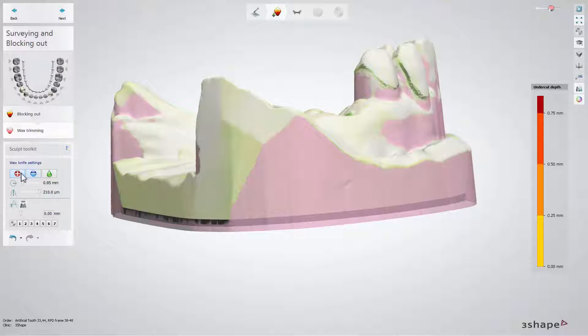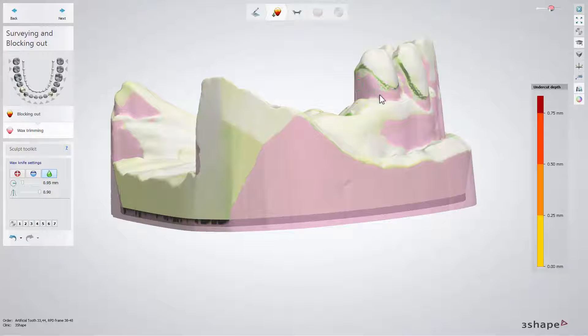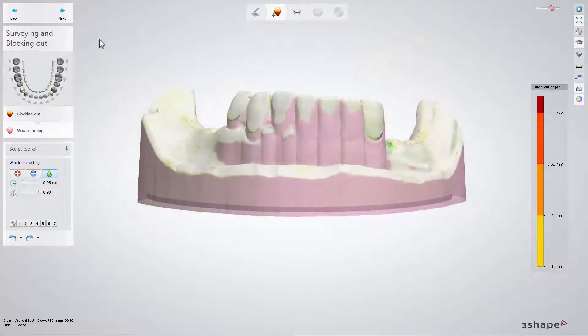Optionally, you can use the Add or Smooth buttons if you need to remove some artifacts or add relief on the scanned surface. To proceed to the RPD design step, click Next.